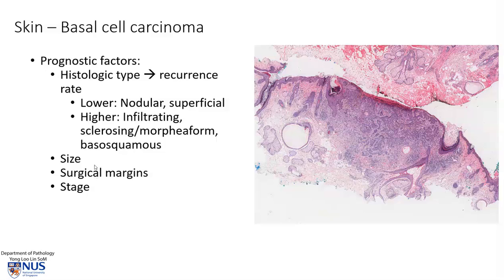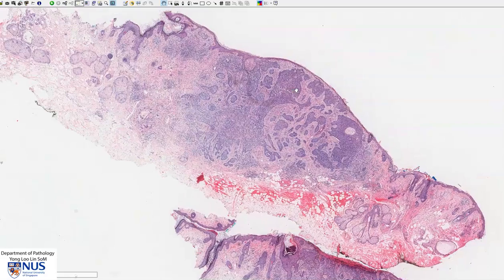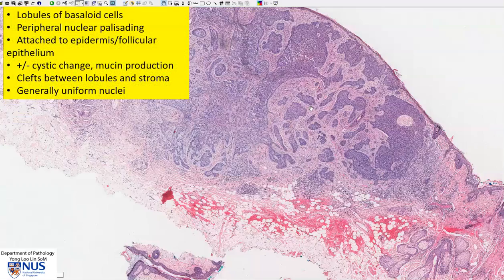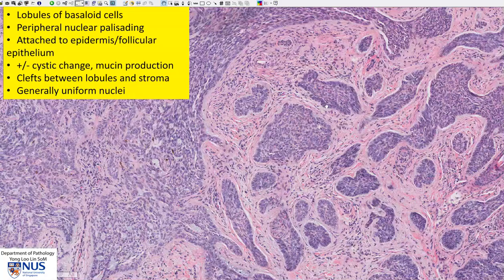Of course, the size, the status of the surgical margins, and the stage are also important. In summary, this is an example of basal cell carcinoma of the skin. This is the nodular type of BCC, which is one of the commonest types, and we can see that there are invasive islands of basaloid cells which are quite uniform.